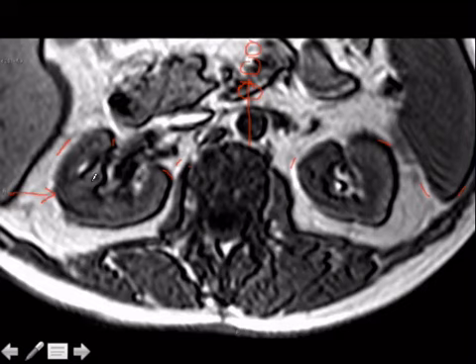The follow-up is, how do I know that's frequency and how do I know that's the phase encoding? Well, by convention in body imaging, the phase encoding direction is supposedly the shorter one for time, and frequency is the longer one, where you're having more space through, and it all has to do with table time. Now, what's the exception? Remember, exceptions are testable. The exception is breast.